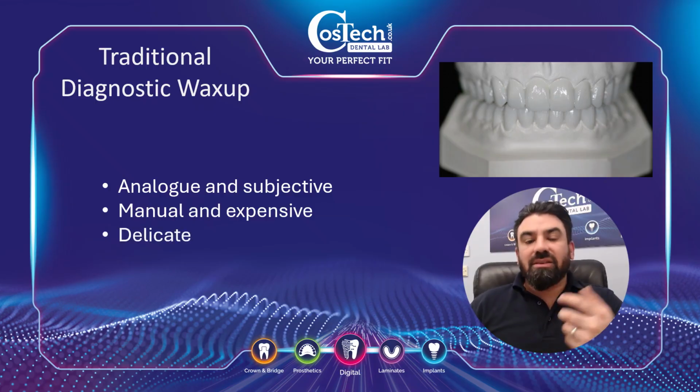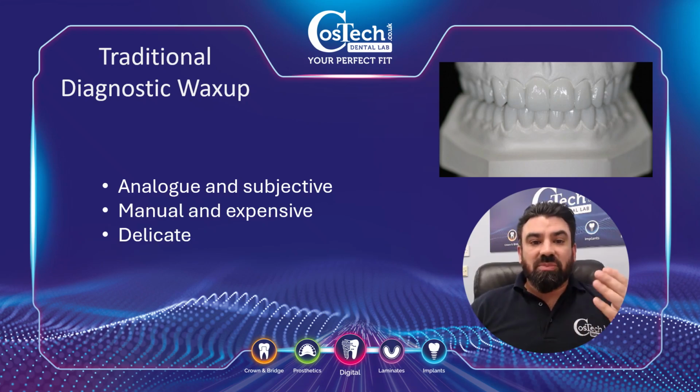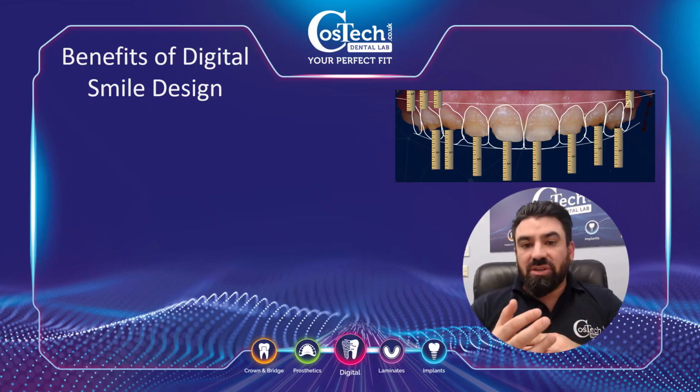The other thing we found is that the majority of the returns we got, especially when we were sending things through the post, was that the wax was brittle and it was just chipping off. So before you even got to show it to the patient, the wax was already chipping off, which was never a good look. So we started bringing in the digital side, and the software that we use has some amazing tools.